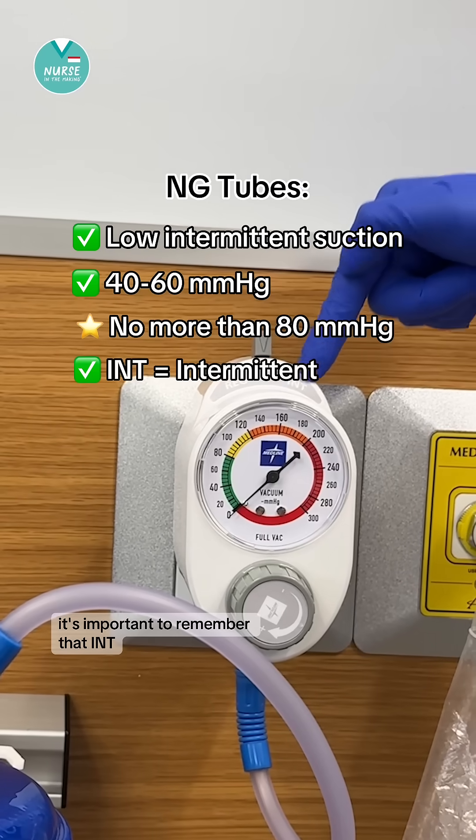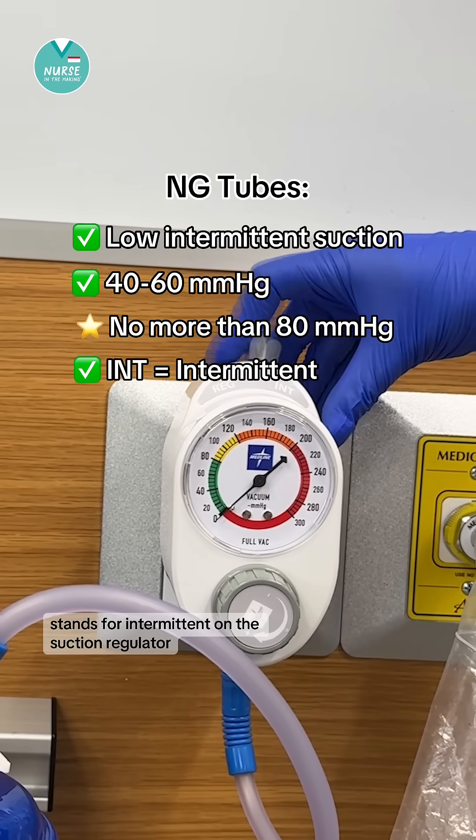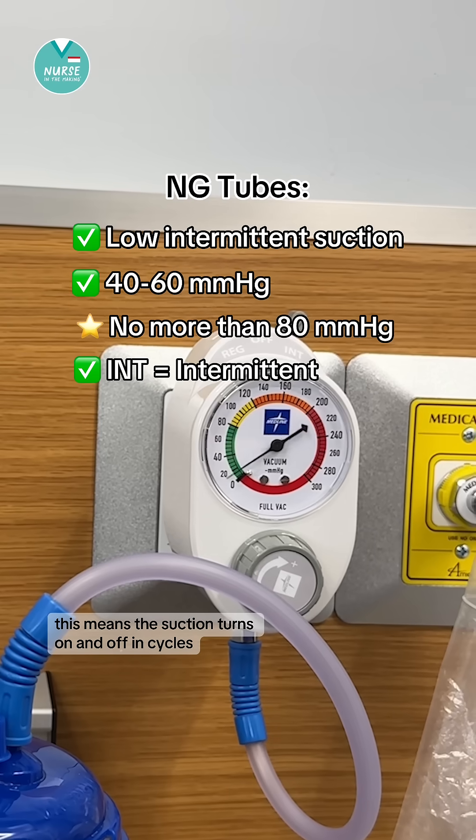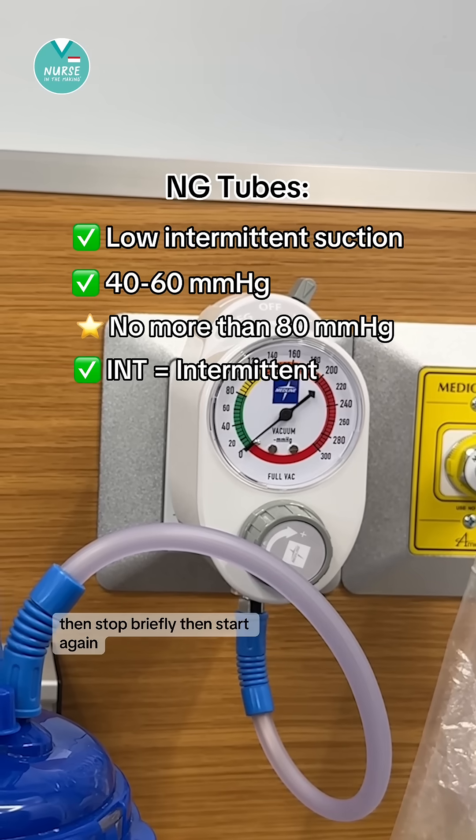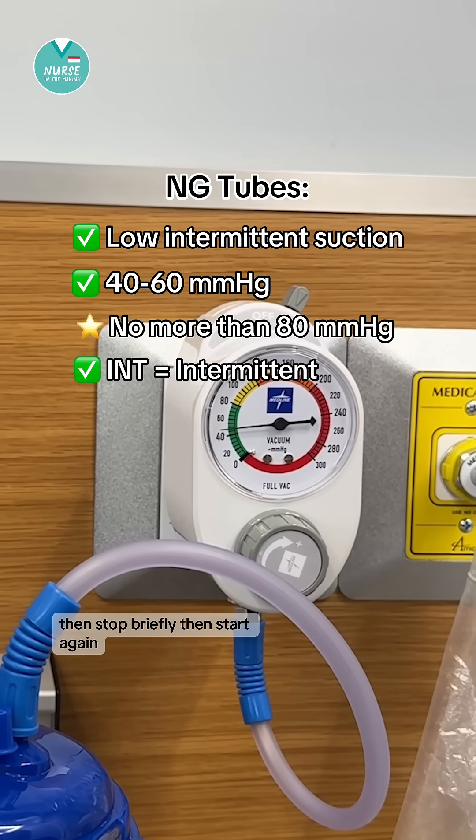It's important to remember that INT stands for intermittent on the suction regulator. This means the suction turns on and off in cycles — it will suction for a few seconds, then stop briefly, then start again.